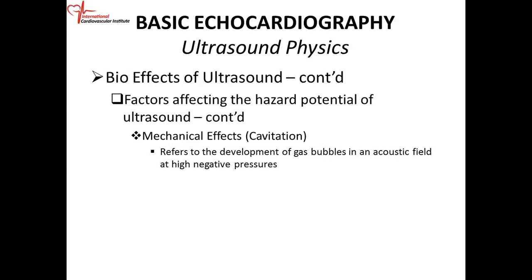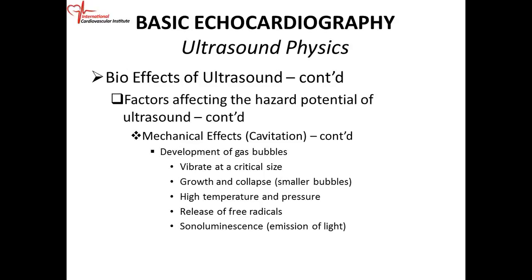So remember when we said the sound wave causes compression and rarefaction, it is the negative pressure, the rarefaction portion, that results in bubble formation. So you can create bubbles in the fetus when you're doing your scan, especially if you use pulsed wave or CW for any long period of time. So you have to bear that in mind.